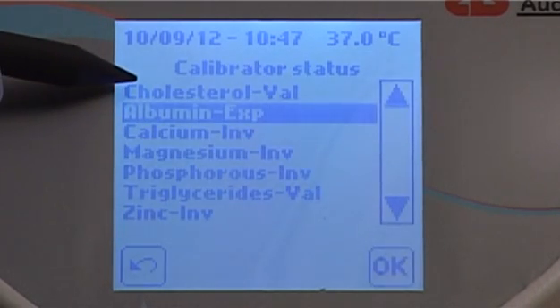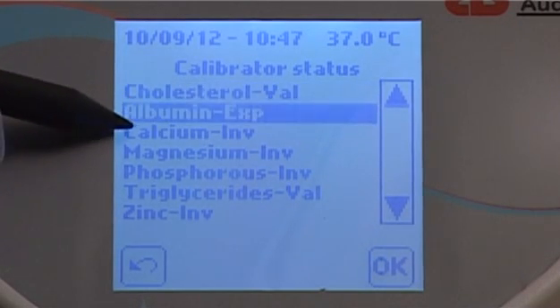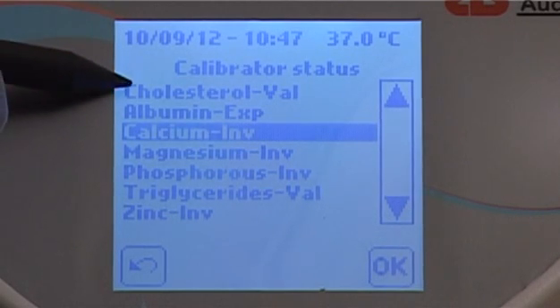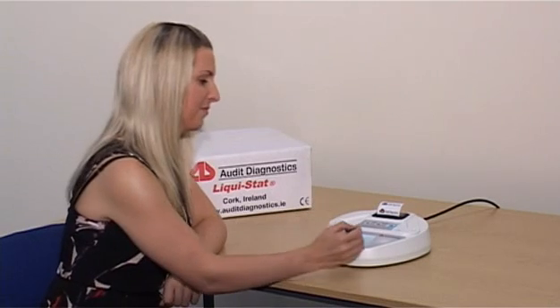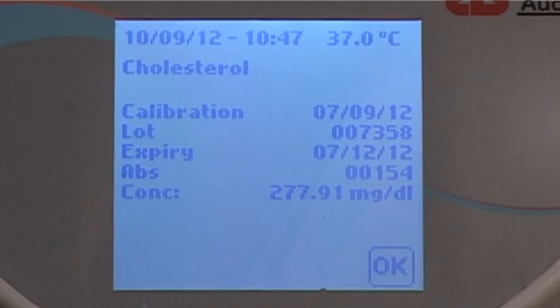A calibration can have three statuses: Valid, Expired, and Invalid. A calibration needs to be valid for a test to be performed. To view the details of any valid calibration, press OK. The calibration date, lot number, expiry date, absorbance, and concentration will be displayed.